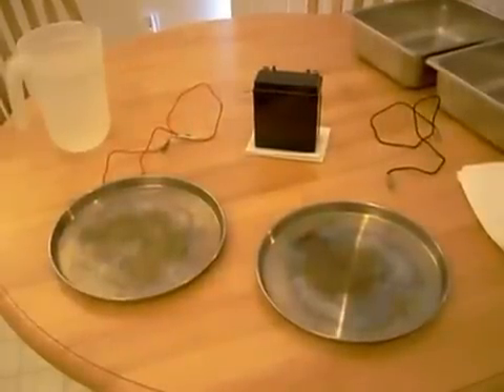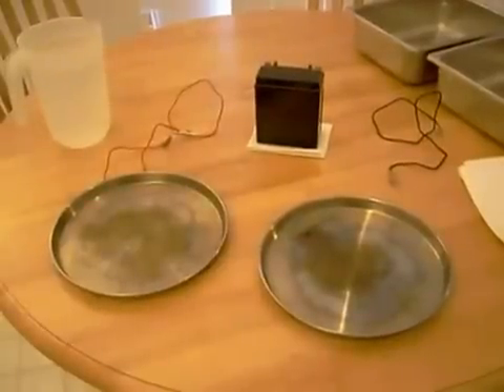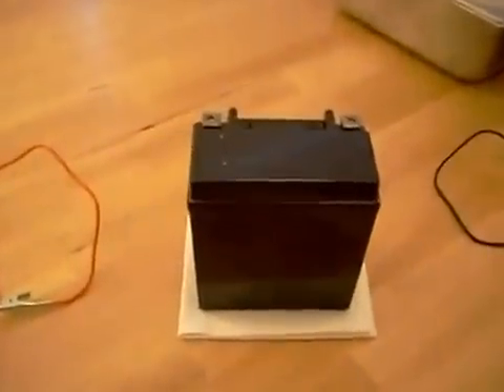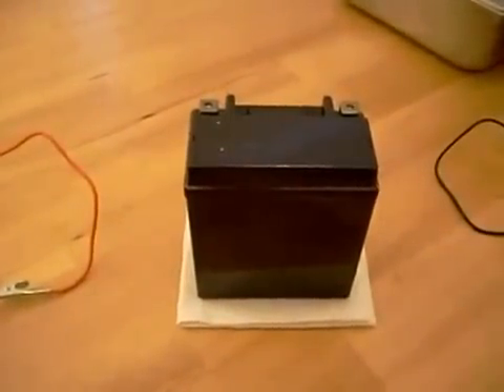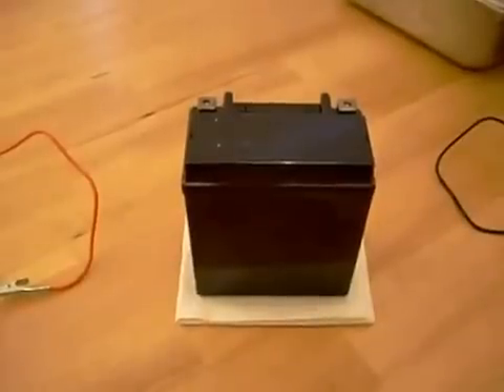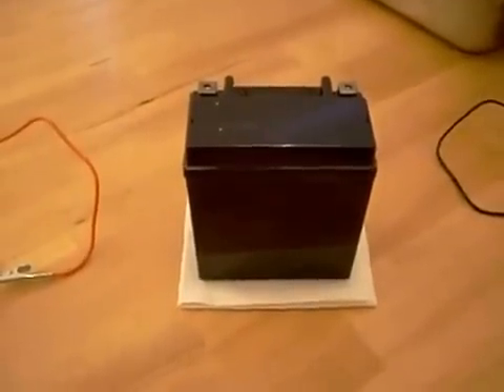This is a demonstration that will help you cure your sweaty hands or your sweaty feet, a condition known as hyperhidrosis. We're going to be using today a standard 12-volt battery. This is a motorcycle battery, but it could be any 12-volt battery — a lawn mower battery. You can usually pick these up at your local department store for about $20.